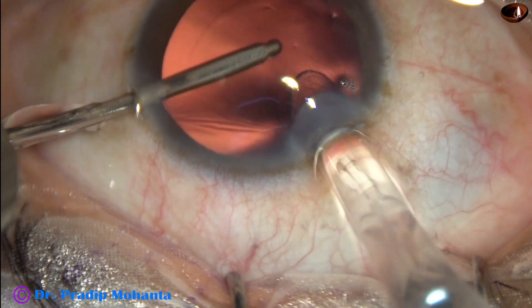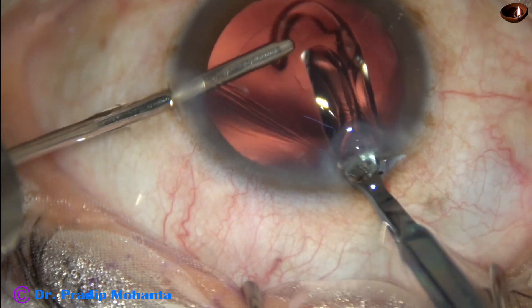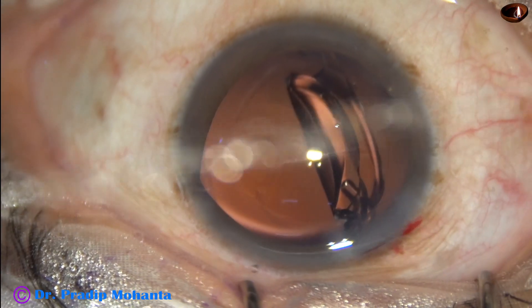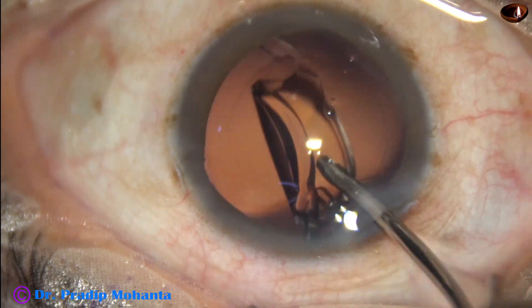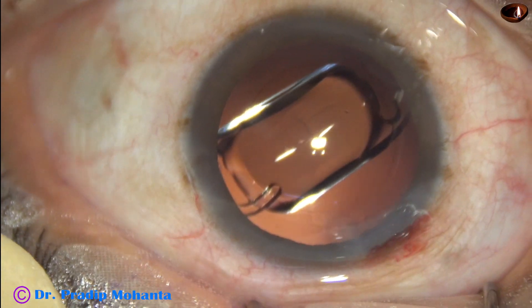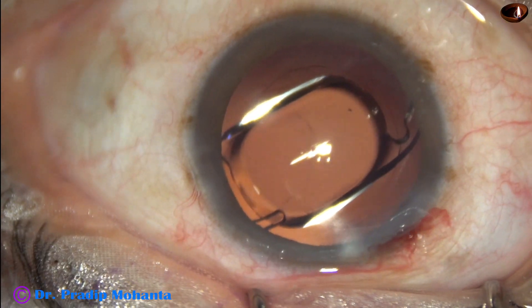Now hydro-implantation of the Sensar intraocular lens is done. The irrigating cannula goes through the main wound and the lens is placed in the bag. We haven't used a Sinskey hook for placing the intraocular lens in the bag.